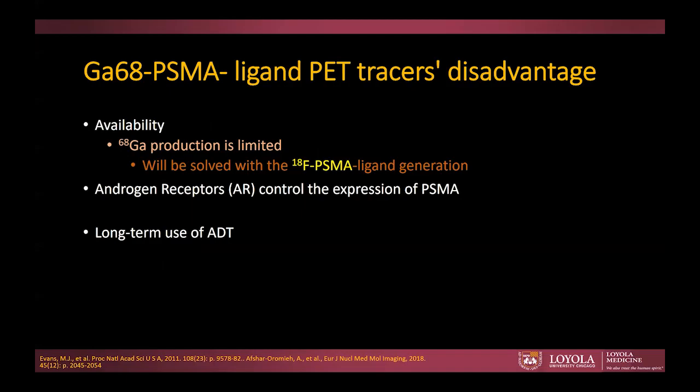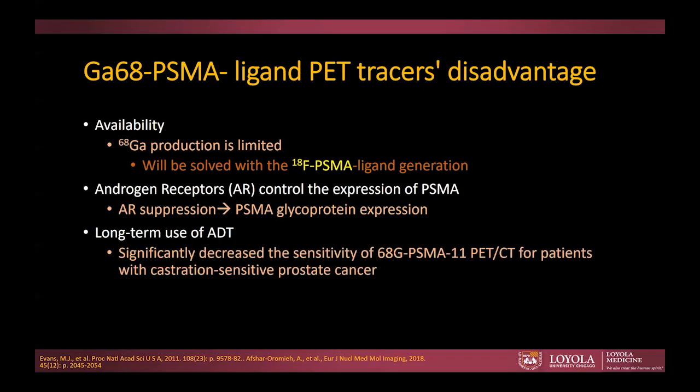We also know that patients receiving a blockage of their androgen receptors may have altered PSMA expression, and it may actually result in overexpression of them. And we do know, preliminarily, that a long term of ADT usage may affect the sensitivity of gallium PSMA performance.